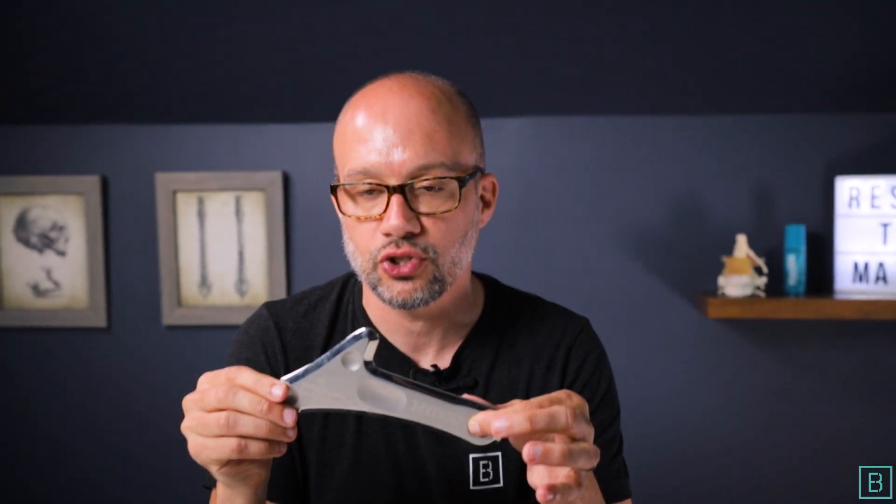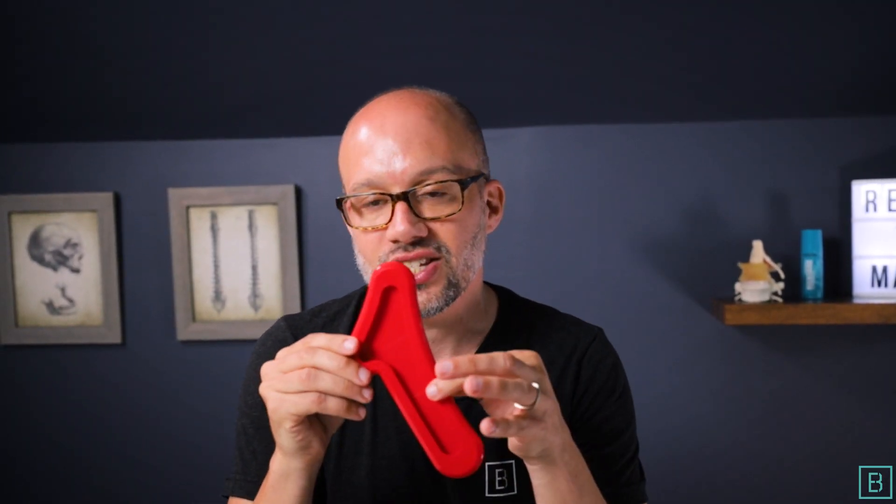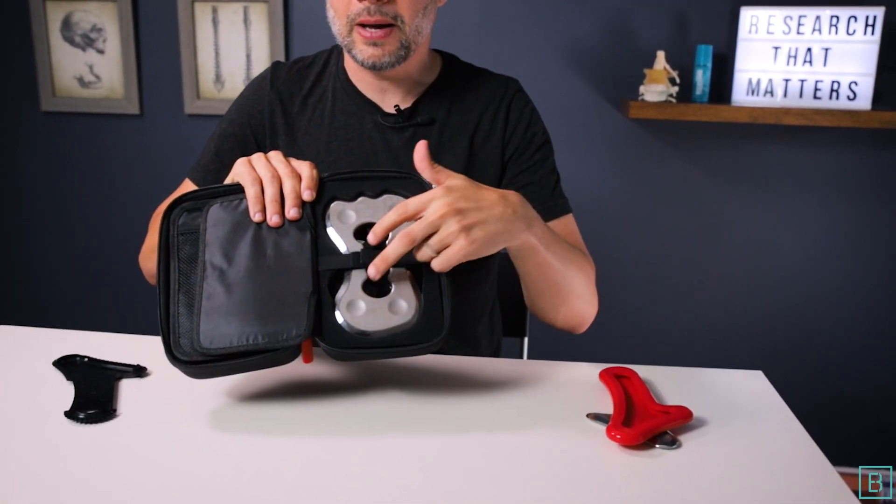Number one, you have the surgical stainless steel tool itself. Number two, you have a silicone sleeve. And number three, you have an ABS comb. All of these enable you to get in there on the tissue and fascia and get the clinical result you are looking for. As an added bonus, you get a carrying case which makes everything convenient and easy — no more lost tools. And finally, if you have Mallet and Mullet, the original RockBlades tools, there's a spot for them in there as well, so you can have easy access in the clinic or on the go.